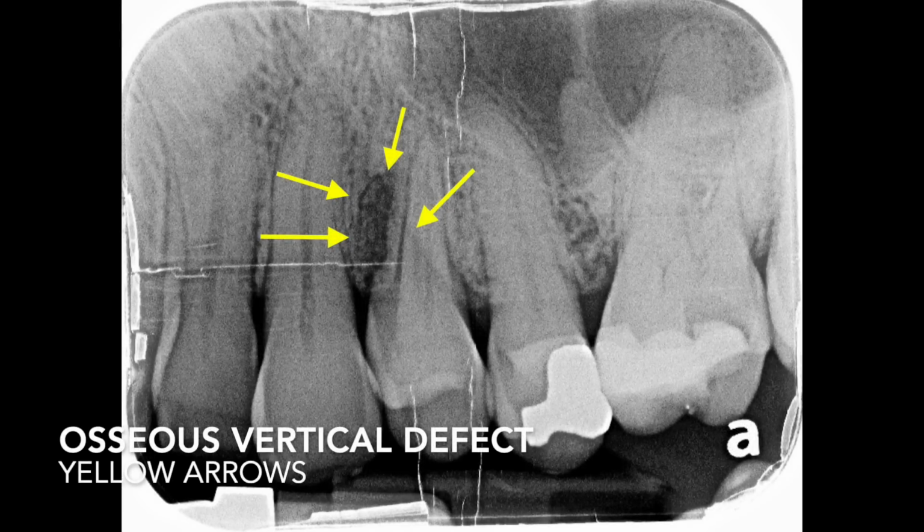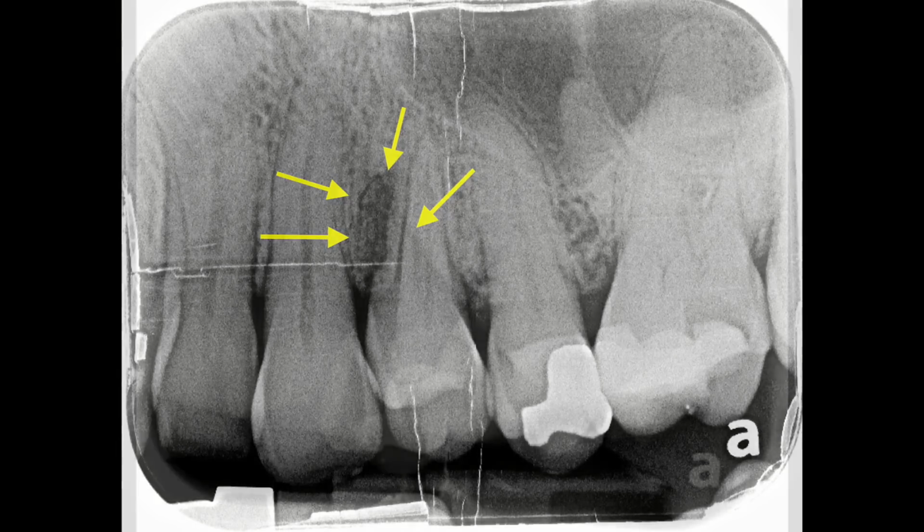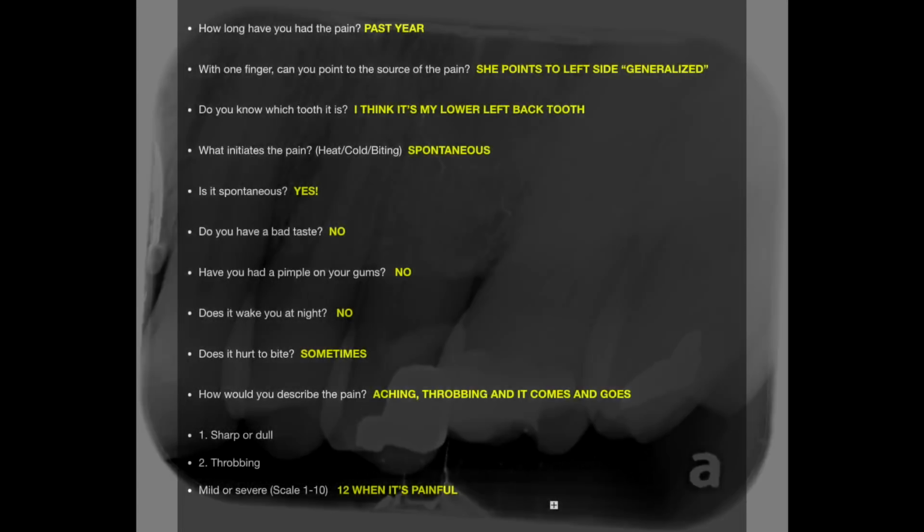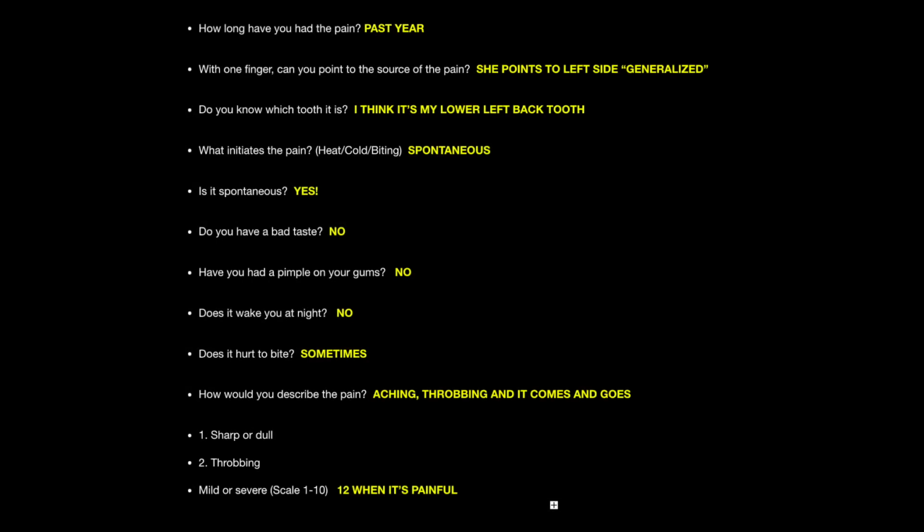If you couldn't point out the radiolucency, there are arrows just indicating it. The next shot is a shift shot showing you something similar. You can subtly see the radiolucency on that tooth. This next image just goes over all the questions that I asked during my endodontic interview to determine the patient's symptoms. You can pause it and review it if you want. I'm not going to go through all the questions.